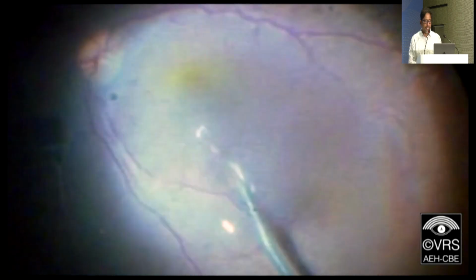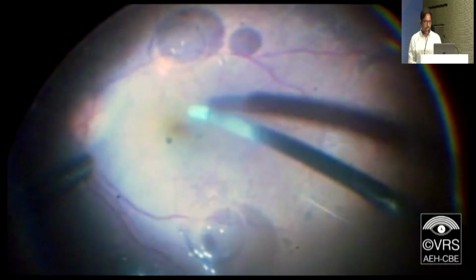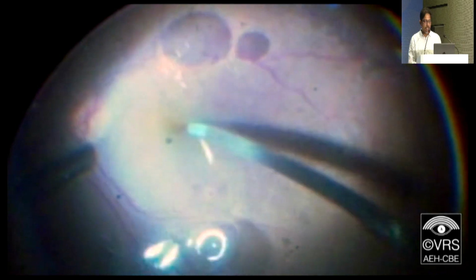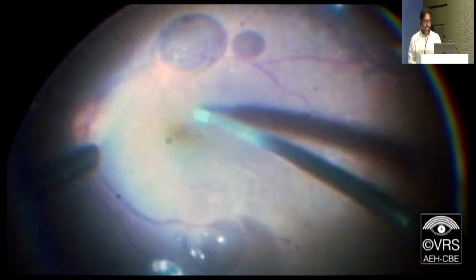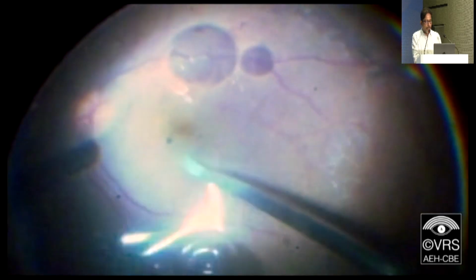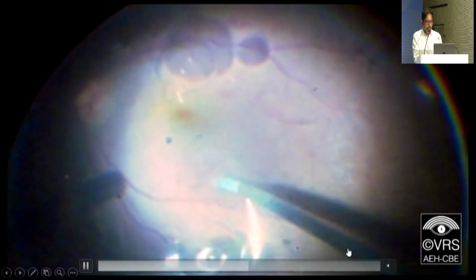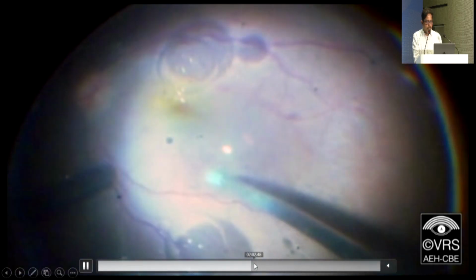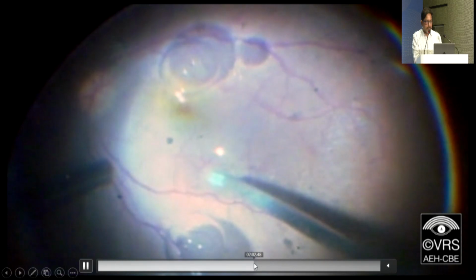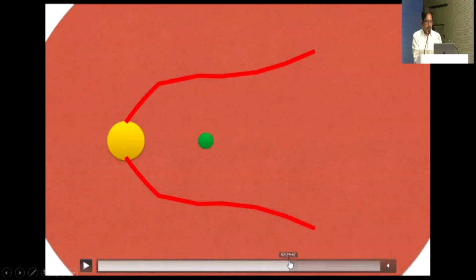BSS is injected under the retina. And then you aspirate this either using a 25 gauge suction cannula or a 27 gauge suction cannula, whichever you have access to. Before that, we just mobilize the PFCL so it's loose and easily aspiratable. So once you aspirate the submacular fluid, the PFCL also gets removed along with it. So this break need not be lasered, but because it was a one-night patient, I just wanted to make sure it doesn't go for an RD.